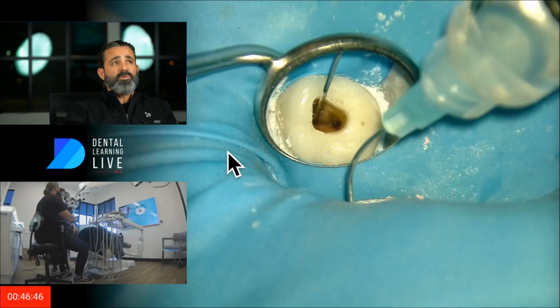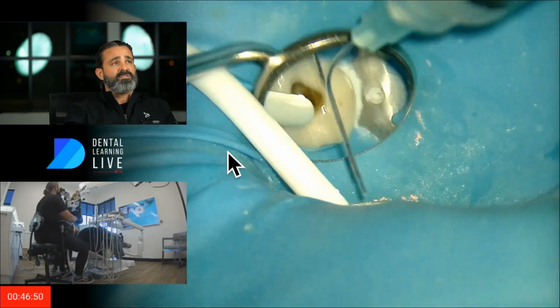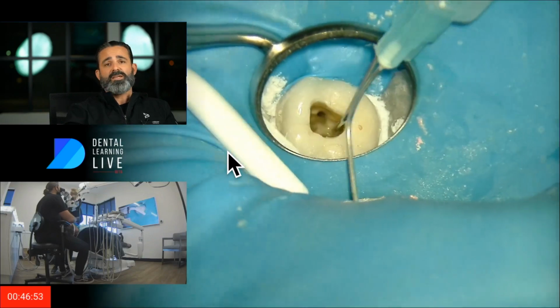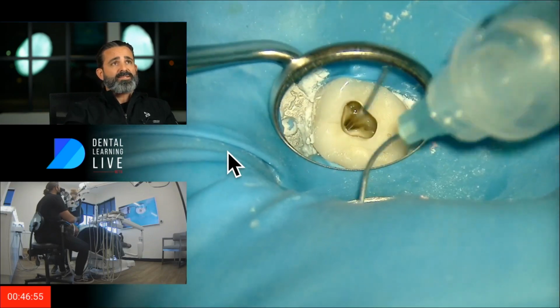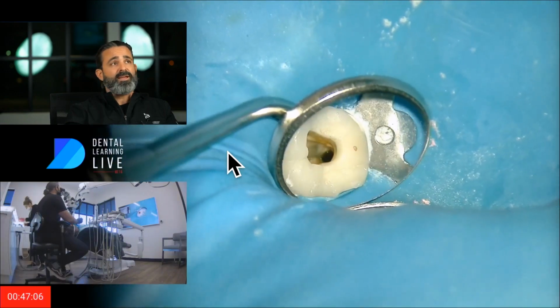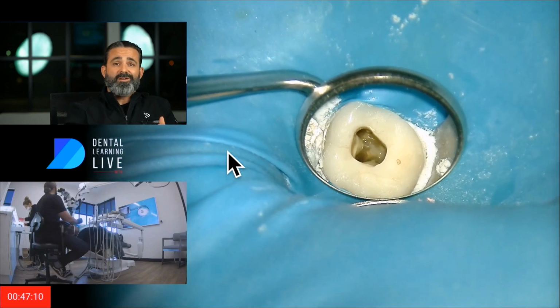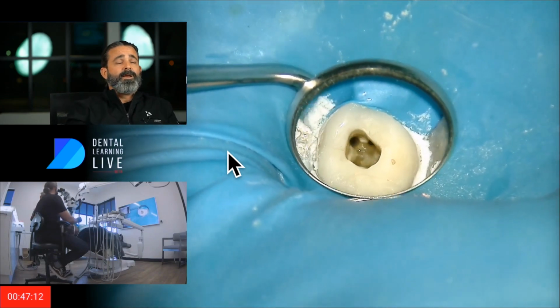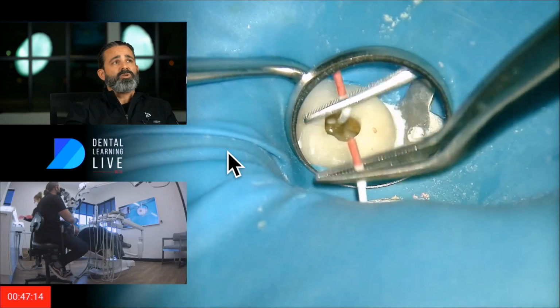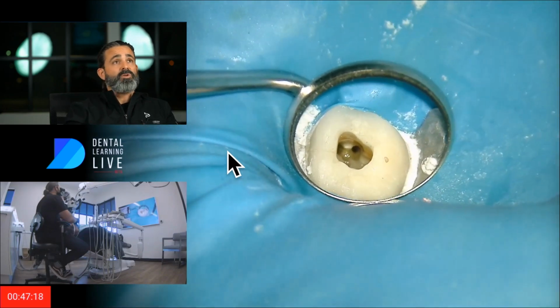Now, hindsight will be 20/20, as it always is. I'm not going to know if this is successful until I get my recall. But I've been at this long enough and done enough recalls that I am getting very, very confident that it will. And so I will have to show you a recall, since I just did this case, resolution. I'm going to show you resolution of this, or not. If it doesn't work, I will show you either way.